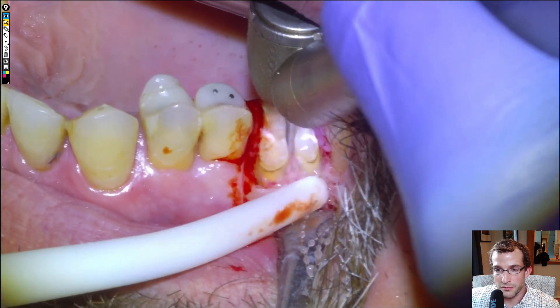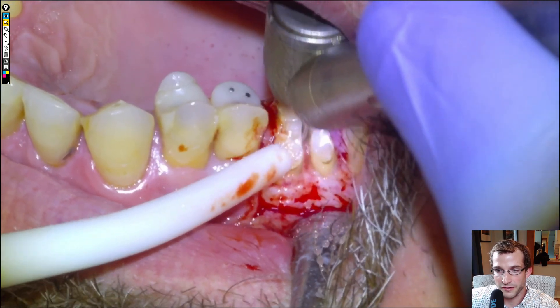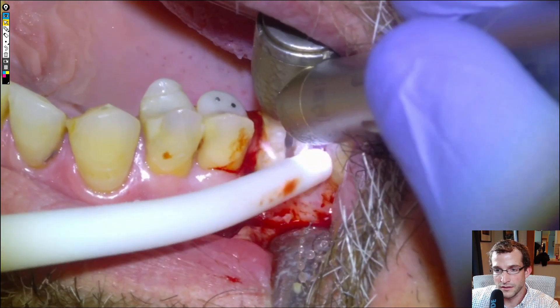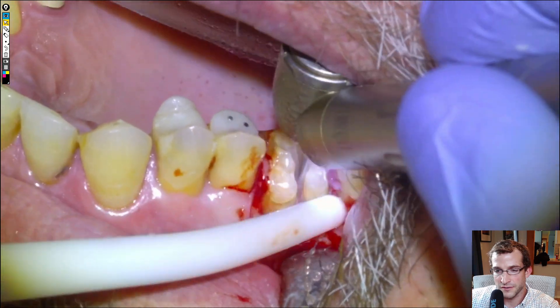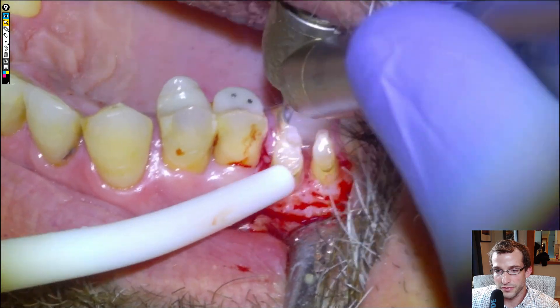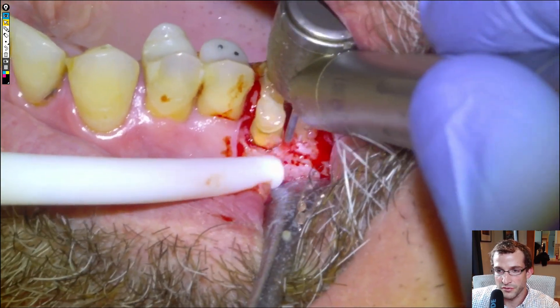We'll section the roots apart all the way down to the bone through the furcation. Once we've separated the buccal roots from each other, we'll separate the buccal roots from the palatal root by making a little peace sign — for the distal and then for the mesial. And once we've done this, we'll be smooth sailing removing the roots individually.